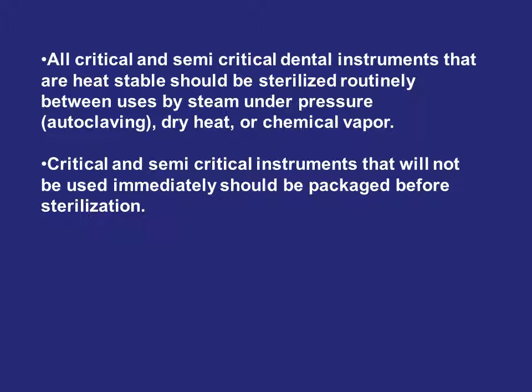Semi-critical instruments are instruments that come in contact with mucous membrane or non-intact skin, such as the dental mirror, the amalgam condenser, the impression trays, and dental handpieces.